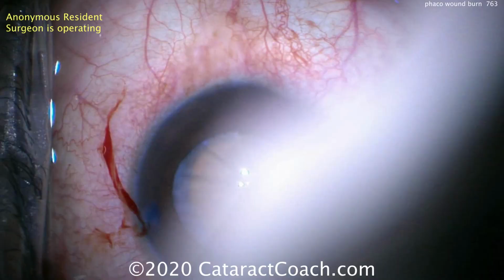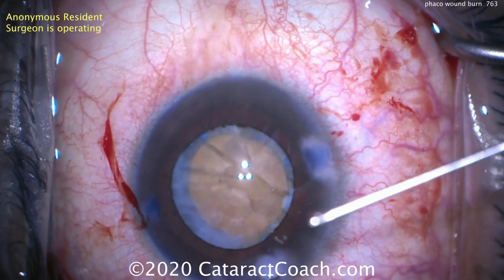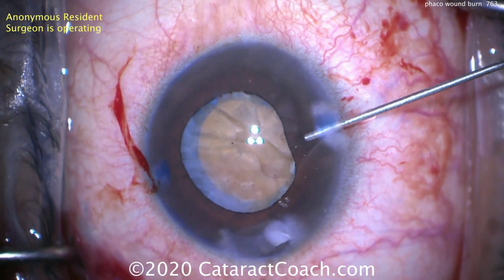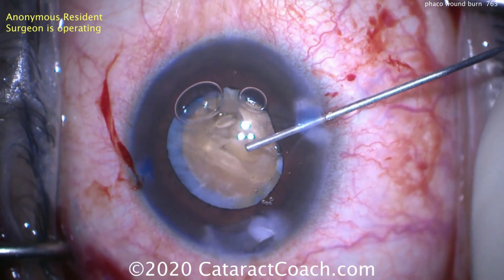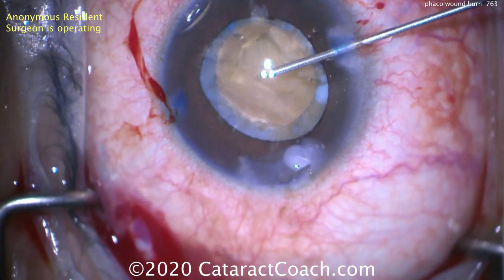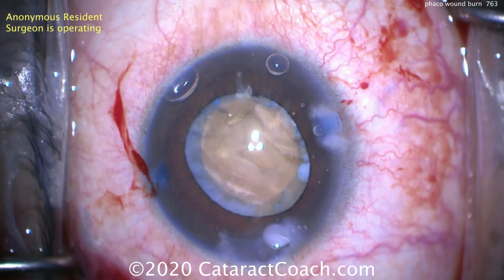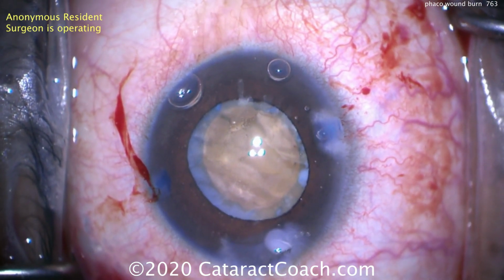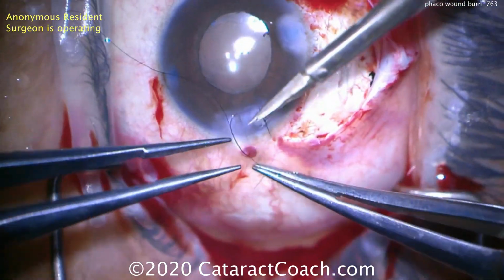So now after all that, when you pull out of the eye, look what happens. That cornea is burned, absolutely burned there. That's a problem. So the reason is dense nucleus, you're putting in more phaco power, and you're not letting the needle cool down. The phaco needle's rubbing against the sleeve and right up against the cornea.